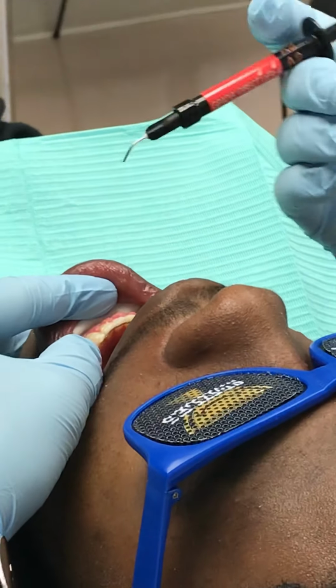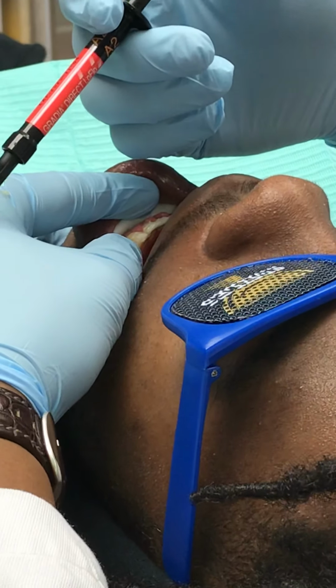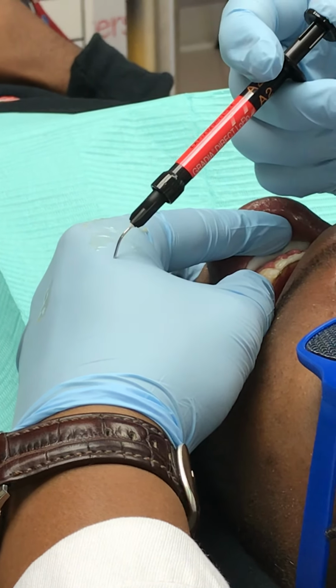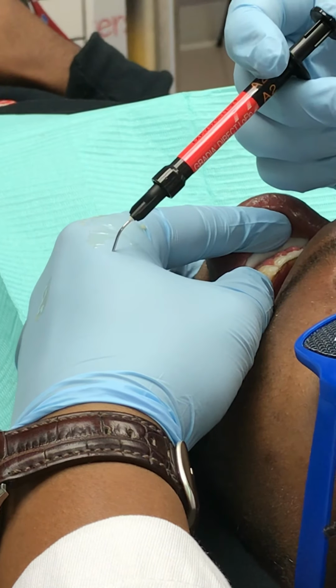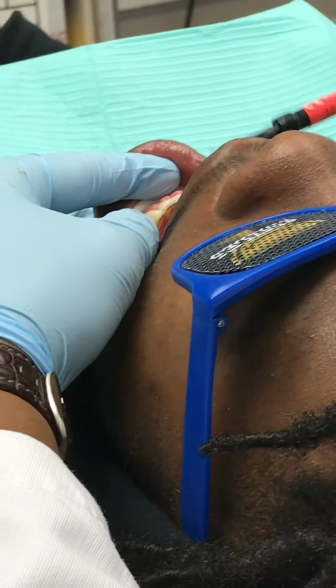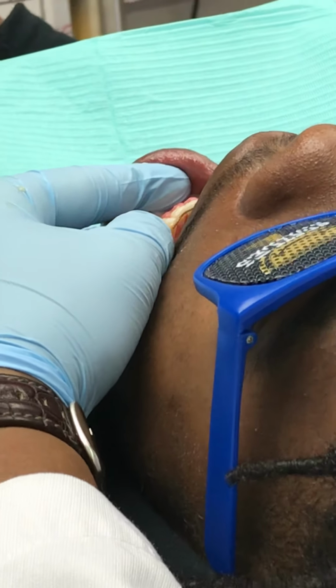And so now, like I said, we're going to just express a little bit out of the syringe tip onto the glove so that we know that we're ready to go straight to the tooth. Okay, we're good to go there. Now, from here, we're going to start with the lower left canine. Open as wide as you can for me.